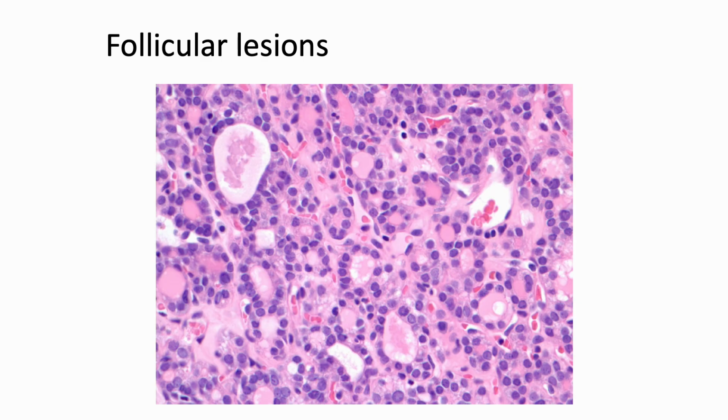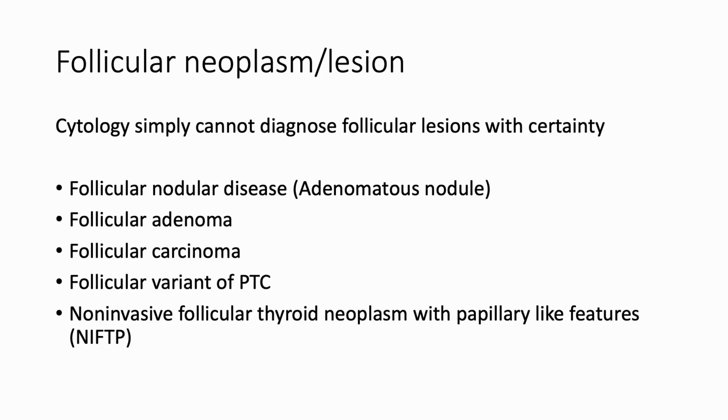Now imagine taking a picture right from the center of any of these lesions. That's essentially what we see on cytology, just a collection of follicular cells. But we cannot see the capsule or determine whether there's invasion. So essentially, cytology cannot diagnose follicular lesions with certainty.